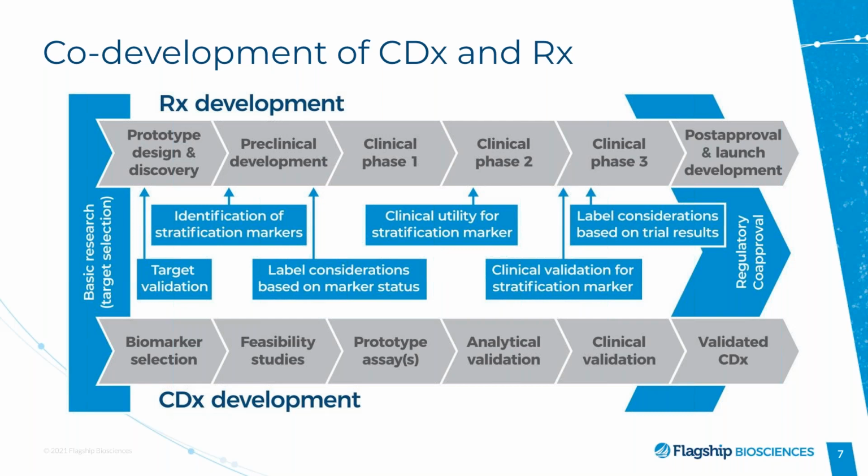So, we took this RNAscope assay, ran it on these clinical samples, and we were able to show that patients that were expressing high levels of the target of our drug, those were the ones that were driving the most clinical benefit. And after seeing this data, we were at another inflection point. We thought it was strong enough to move this assay along to the next step of the companion diagnostic pipeline. And for us, that was to actually get the assay to a level where we could use it to prospectively screen patients. So this is going to be a fairly substantial jump in the assay.